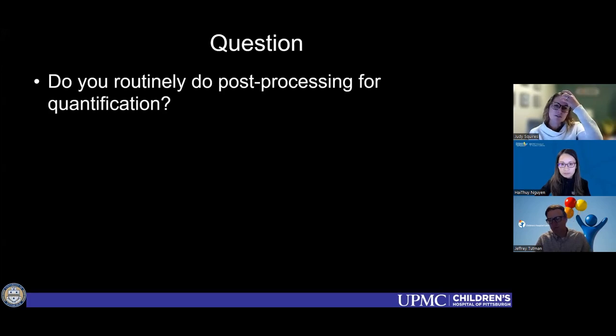Are you just using the software that comes with your machine to be able to do that? Yes. It's only if we're not scanning back-to-back and I have the time to do the post-processing, but it doesn't take that long, I guess. So it's worth it just to have and then look back on.